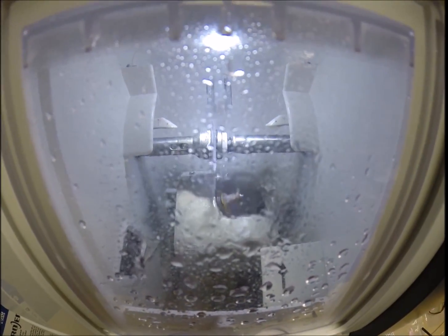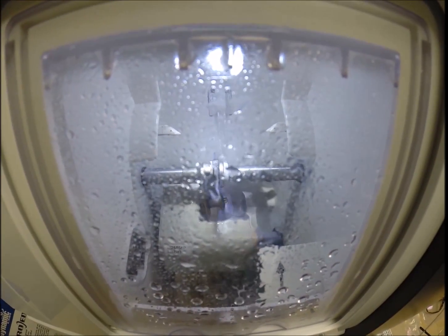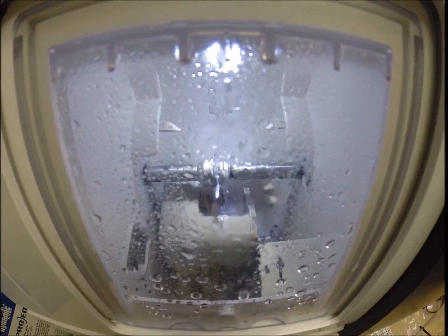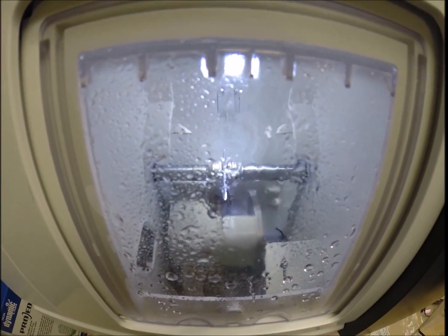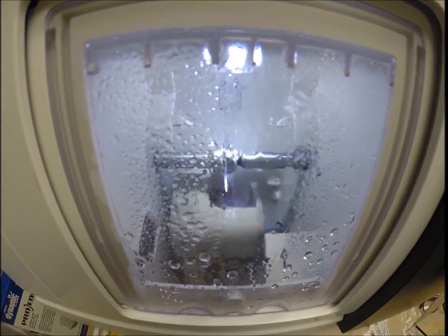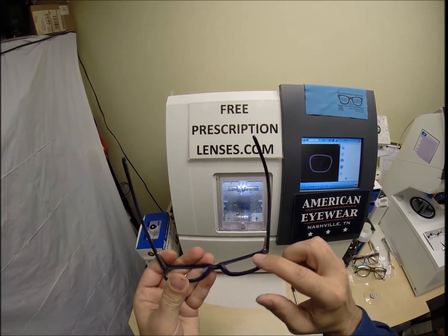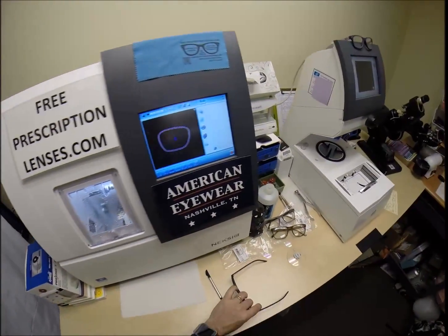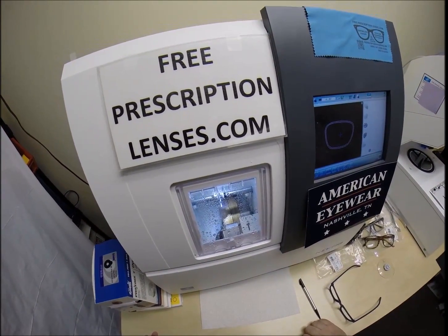Little lever is coming into view. At the end of that lever is a small spinning wheel. That's what's going to apply the safety bevel to the rear concave surface of the lens. Now, I do cut very strong prescription lenses all day long for free when you buy the frame, and sometimes the thickness of the lens causes it to protrude from the back surface of the frame and come into contact with the cheek on a plastic frame, although there will be none on your prescription, but this is a routine procedure I like to do.